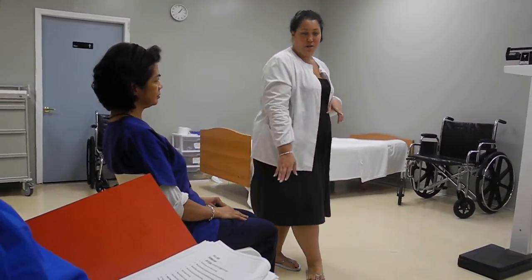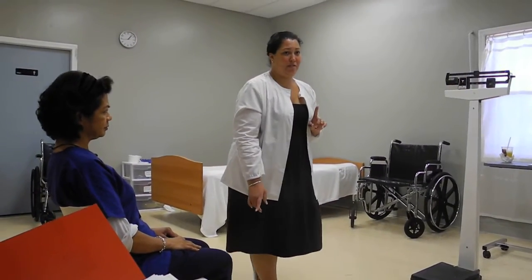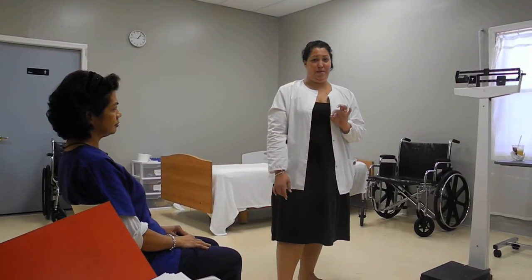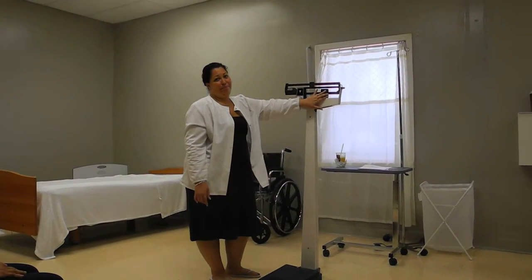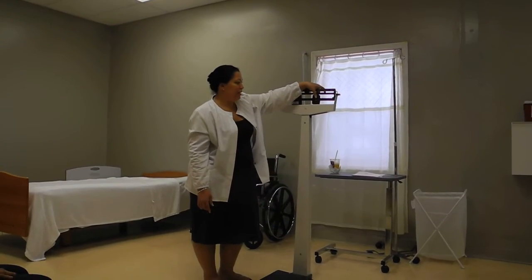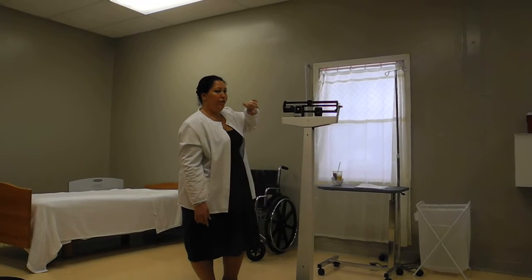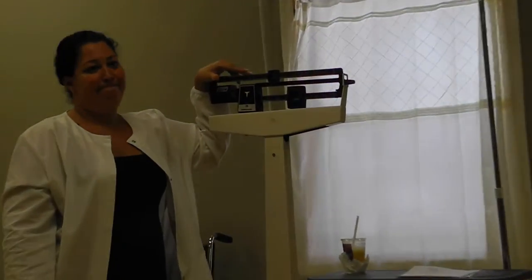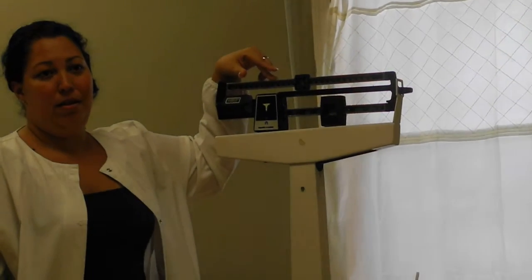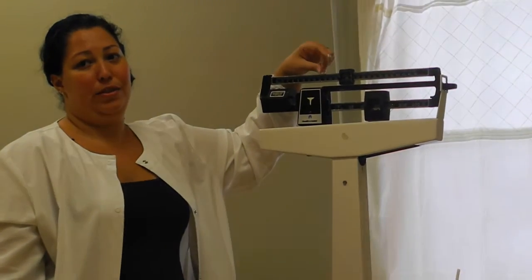You have to make sure that your patient has good shoes. And the next thing, before you get your patient up, very important, you go straight to the scale and put it on 0. They're going to have the scale like this for you, so they know if you come and put it on 0. If you don't put the scale on 0 and you get your patient up, you fail, okay? So just remember, because this is very important. You automatically fail if you don't do this.